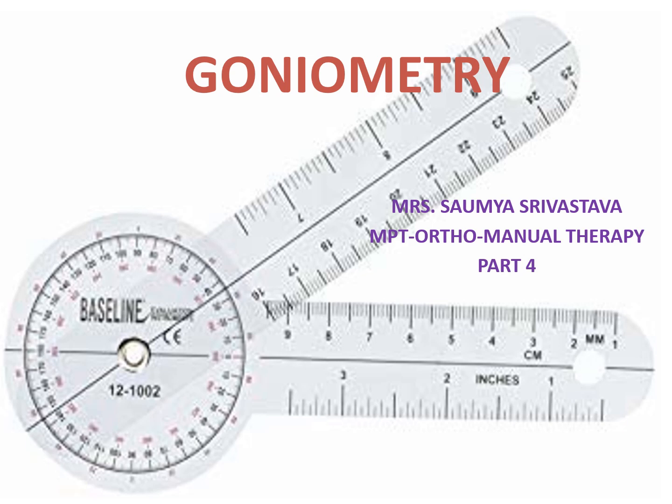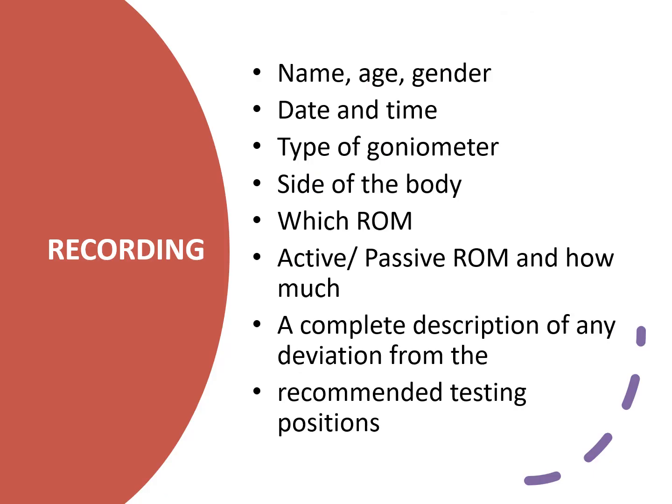what is goniometry. Then we have spoken about the principles of goniometry. Later we learned about the techniques and steps involved in assessing the range of motion using goniometer. So we have finished all the crucial parts of goniometry. Now we'll start with the last part of goniometer. So now we have understood the techniques and principles of goniometer.